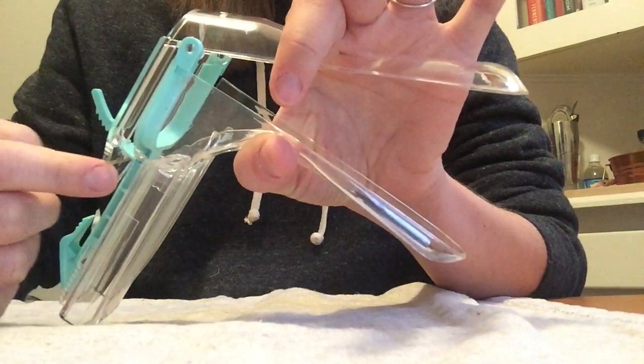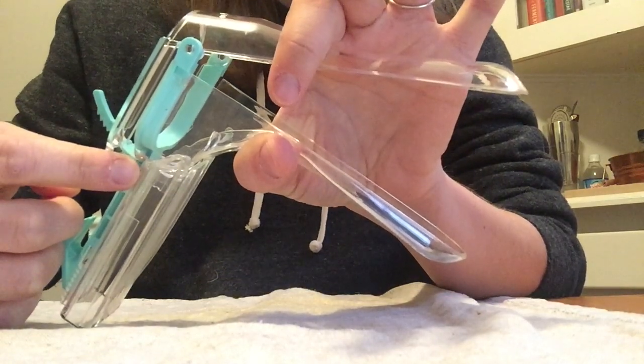With the plastic speculums, they make a clicking noise like that. Don't let that surprise you. Sometimes that's kind of unexpected.